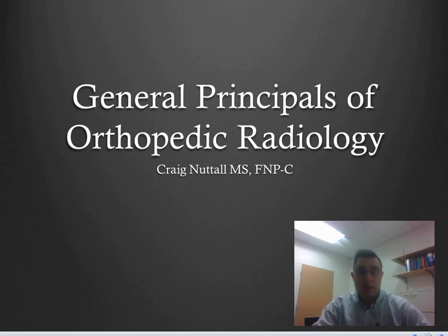You're going to want to know how to read x-rays. So hopefully we can give you some pointers and go over the more common x-rays that you're going to see in the family practice setting.